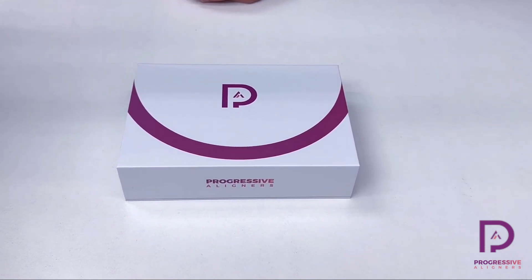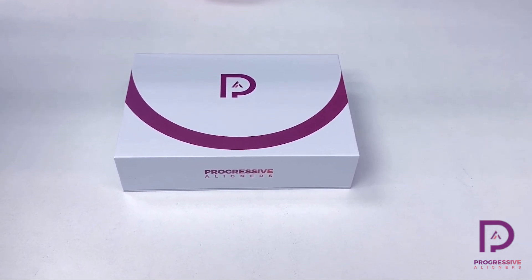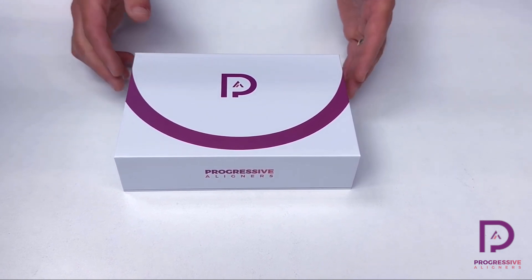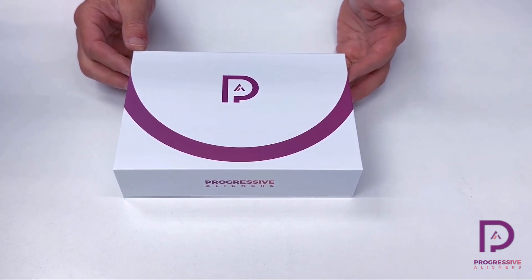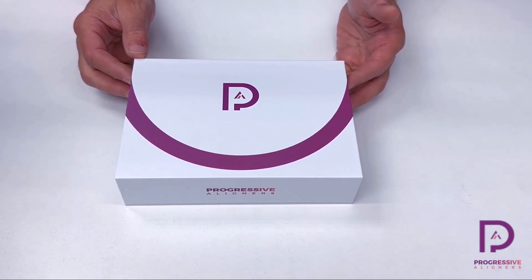Hi everybody, this is Collins Harrell here to show you what is inside of the patient kit that comes with the progressive aligners. This is the box that we call the patient kit that you send the patient home with. Let's look and see what is inside of the kit and what the patient will be taking home.